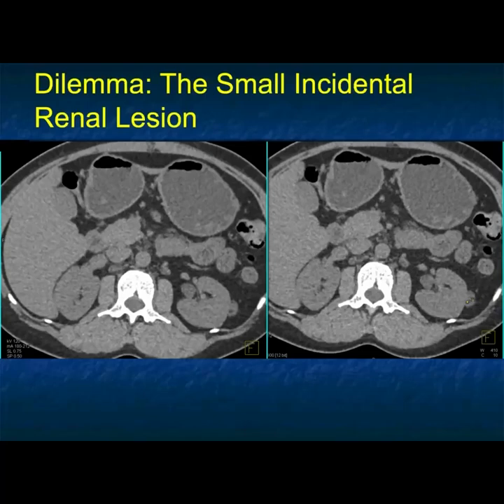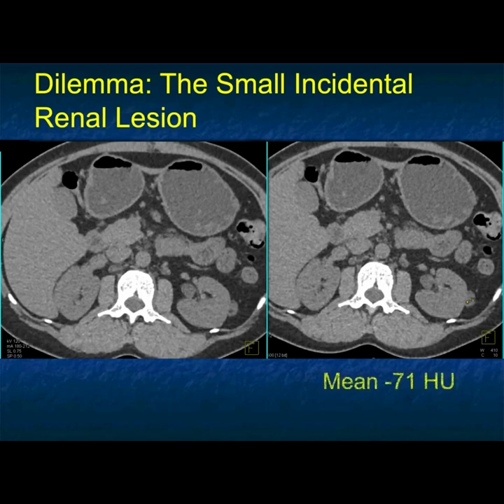Look at this case — that small renal lesion in the left kidney. All of a sudden you're going to look at it and say, what could this be? It's not a cyst, but that little dot there is very important. If you measure that little dot, it measures fat and has a mean of minus 71 Hounsfield units.